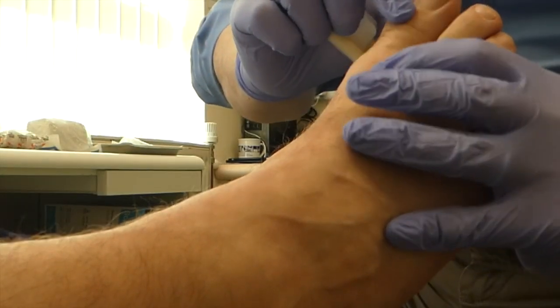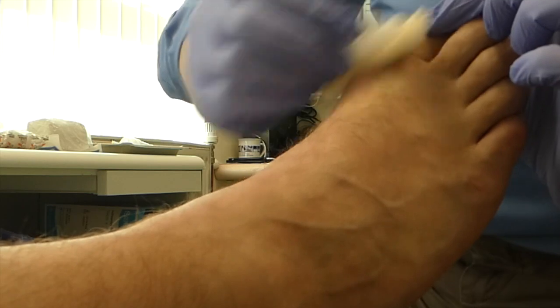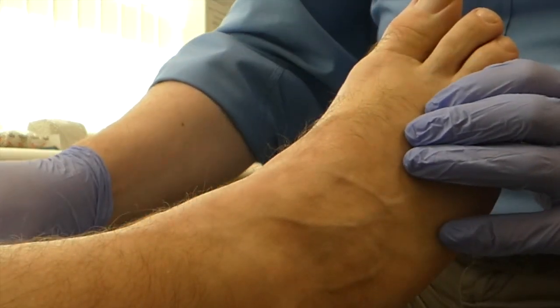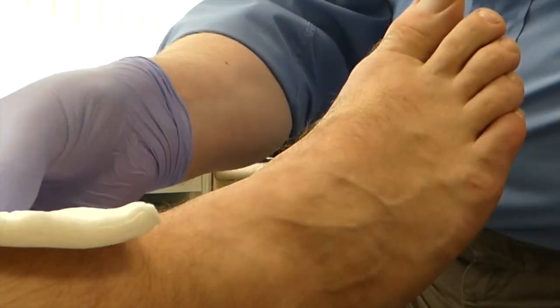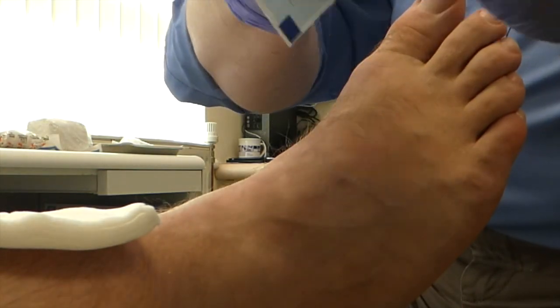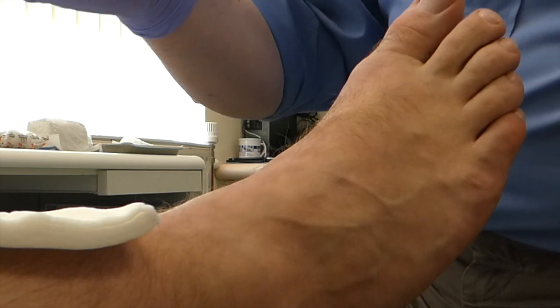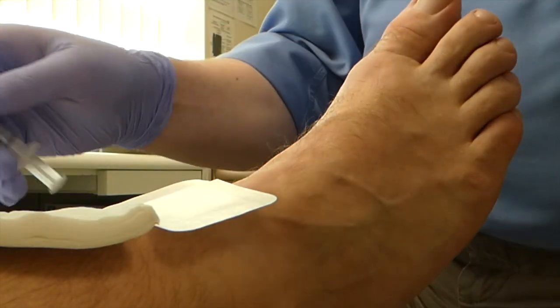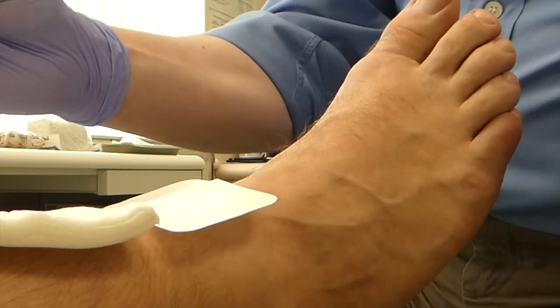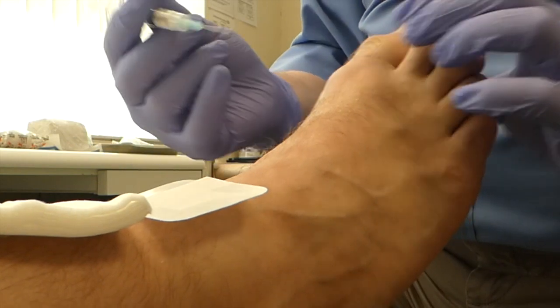So here's our joint. He's got moderate and sore end-range pain in the joint, and we're going to come in from a dorsal medial approach. Have a little bit of gauze ready for any bleeding, bandage ready for dressing. Because he's going to rest afterwards, he will not drive home, spend the rest of the day on light duties — we've had that conversation. He might ignore me.